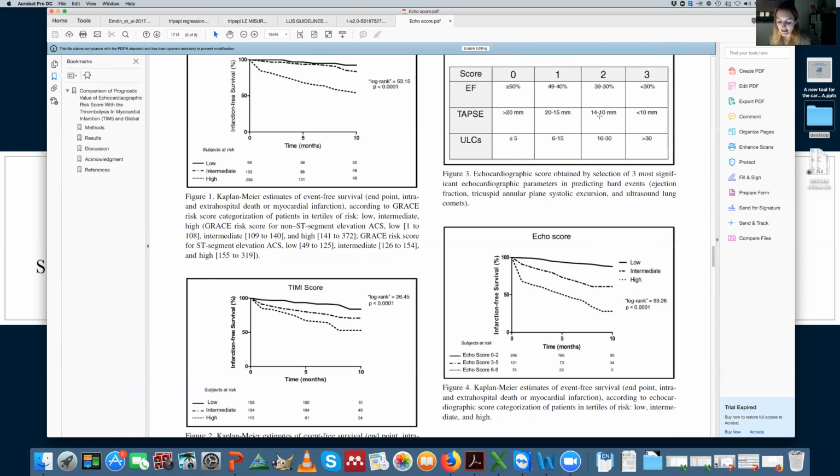In the specific case of a randomized trial, I mean that you take patients with acute heart failure who are hospitalized, and you randomize them to a standard branch, and you just follow up the patients and titrate the diuretic therapy according to the clinical situation, the weight, the symptoms, the chest x-ray, exactly as you would do in your normal practice. And in the other branch, you do this standard practice plus the lung ultrasound. You do the B-lines every morning during the round, and you decide how much diuretic therapy to give and when to switch from intravenous to oral, for example, according to lung ultrasound integrated with the rest of the picture. I mean, it's not only lung ultrasound.